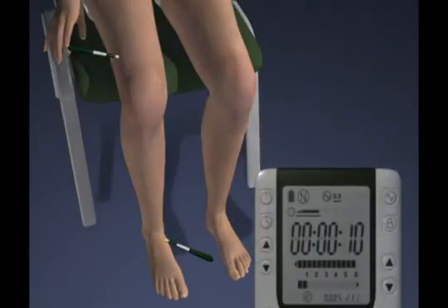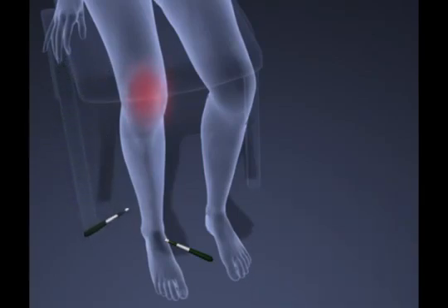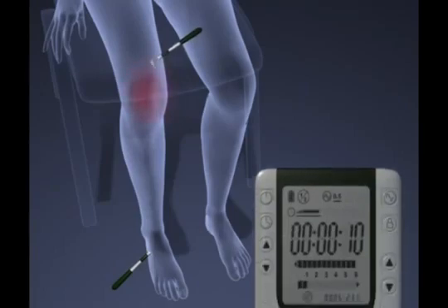The treatment cycle will start with a dual beep on contact with skin and end with a single beep. Hold probes firmly against your skin for the entire 10-second cycle before moving to another treatment location. Lift one probe off of the skin and put it back down in the same place to repeat the treatment. 2 probes must always be used together to complete the electric circuit.